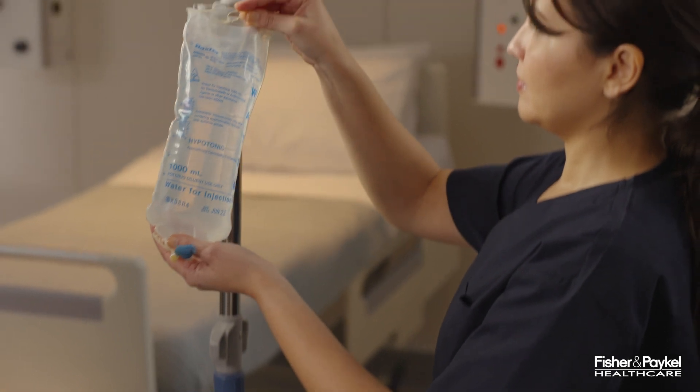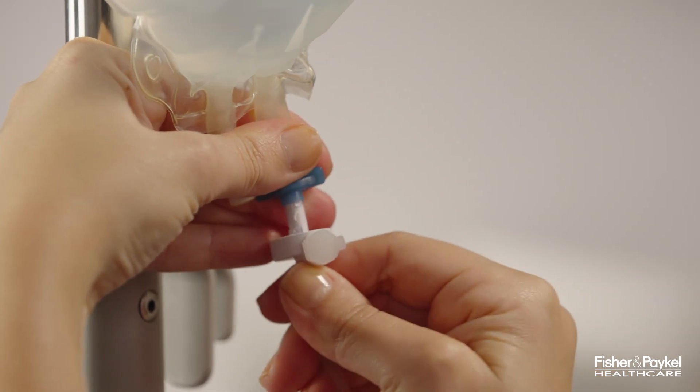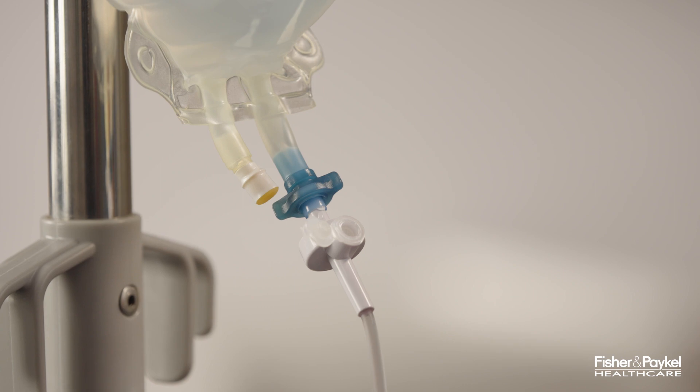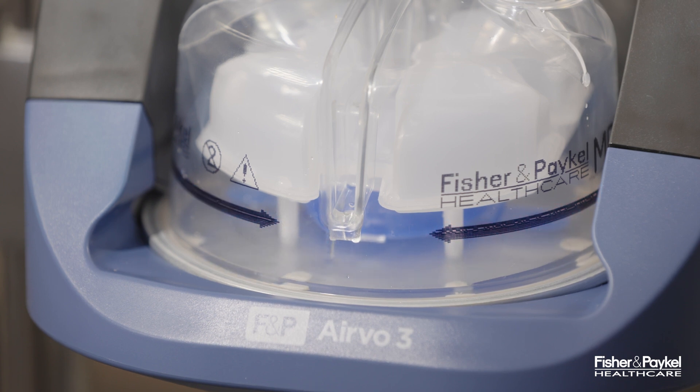Attach the sterile water bag to the pole at least 50 cm above the Aervo 3. Spike the water bag and open the vent cap on the side of the spike. Water will automatically fill the chamber. Check that the water remains below the maximum water level line. The chamber will automatically maintain the correct water level until the water bag is empty.